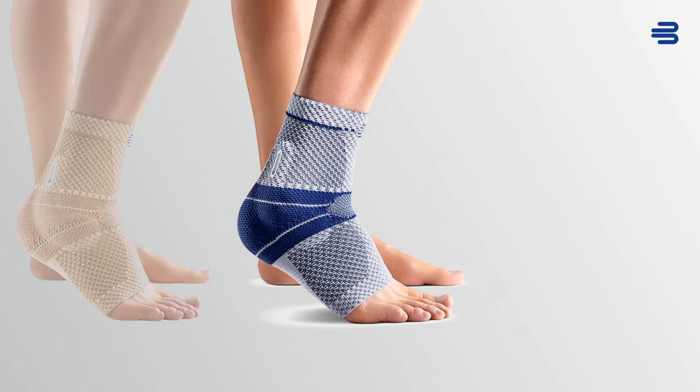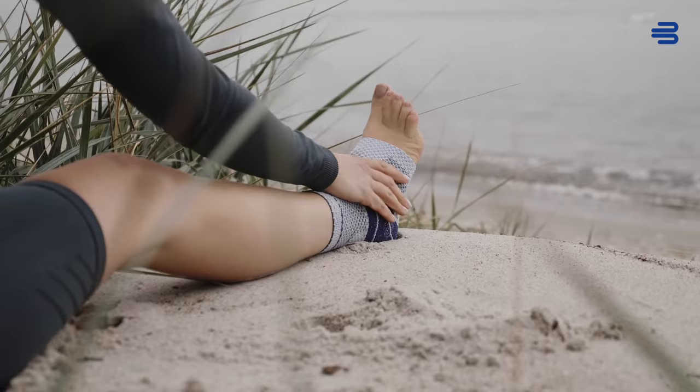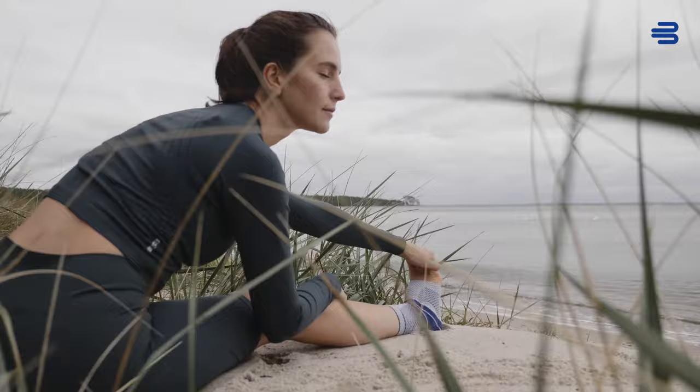The Malleotrain is available in versions for the left or right ankle in six sizes and three colors: Titan, Beige and Black. This support by Bauerfeind can be prescribed by family physicians or specialists as an orthopaedic aid, meaning the buyer will be reimbursed.